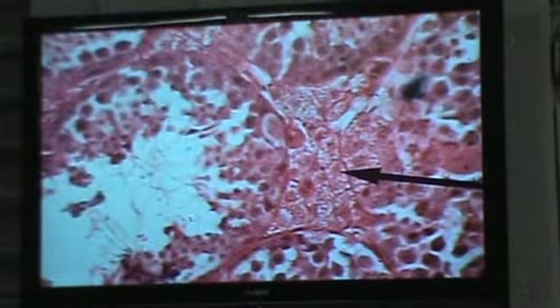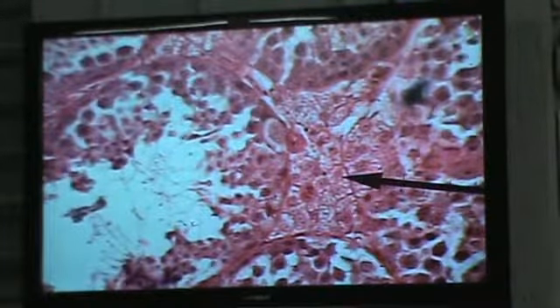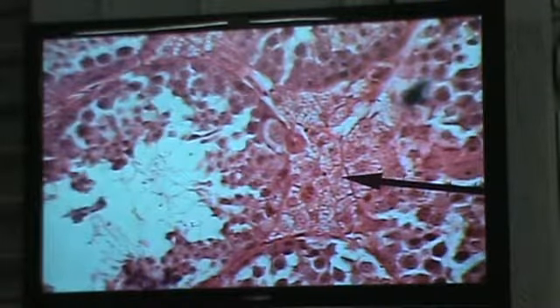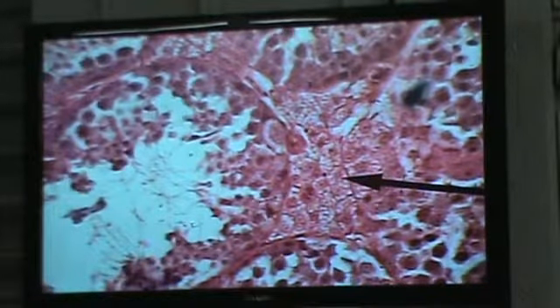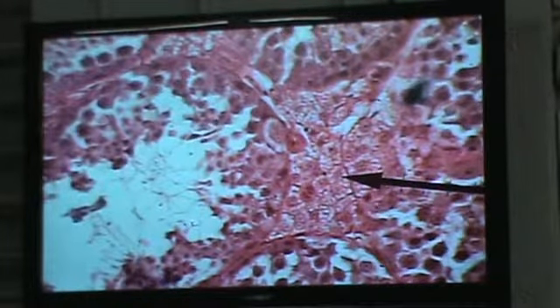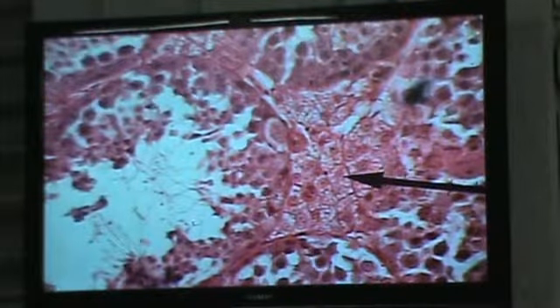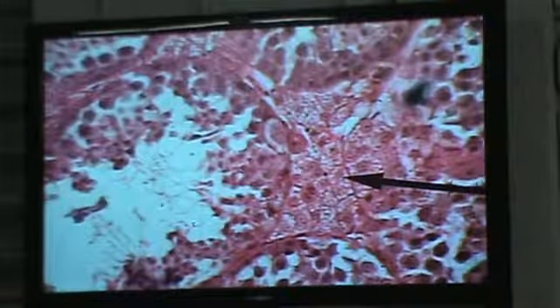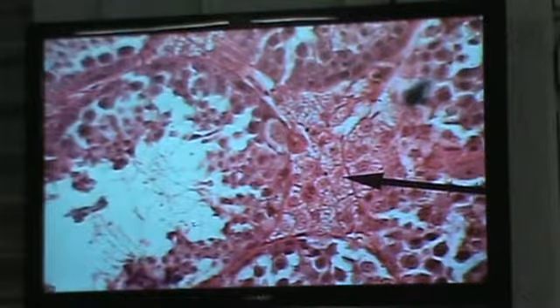So beautiful, excellent, fantastic. You're looking at some beautiful gold medal, platinum Leydig cells. Why is it platinum? These cells are steroidal. They are producing testosterone. The cells are sequestering cholesterol and using it to build up testosterone. What we're seeing here are these cells, and you see all these droplets. These are the lipid droplets. This is a beautiful example of the Leydig cells.